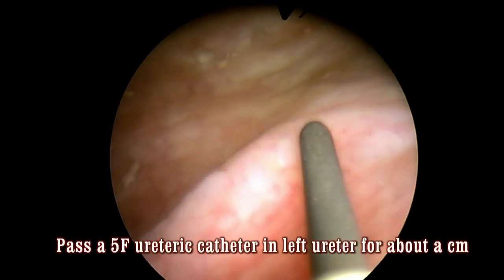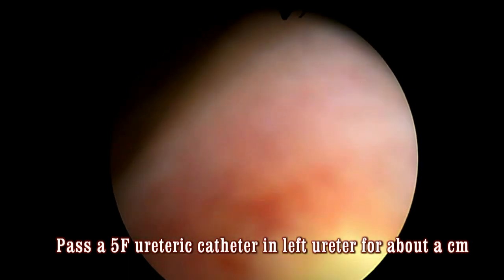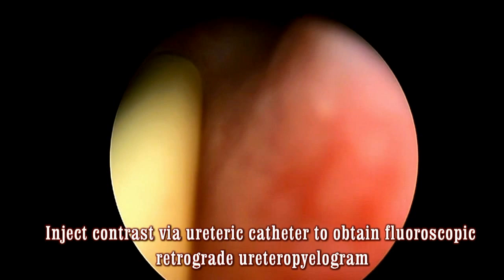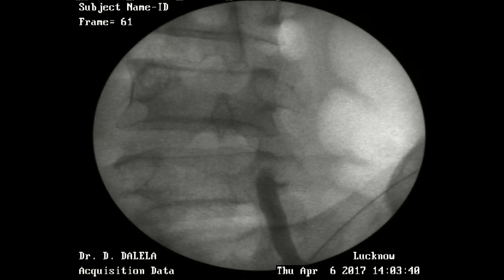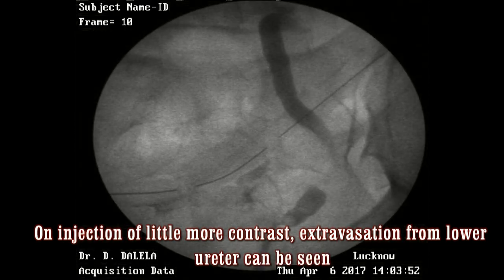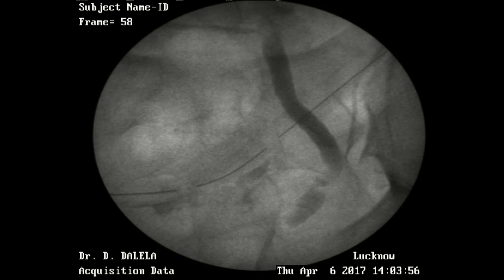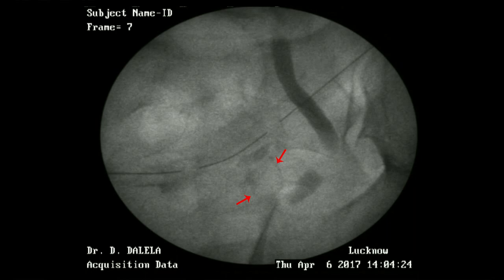Next, you pass a 5 French ureteric catheter into one of the ureters — the left side here — for about a centimeter, and then inject contrast via the ureteric catheter to obtain a fluoroscopic image. As you inject contrast, you will see the dilated ureter, and on injection of a little more contrast, you may see some extravasation from the lower ureter. In this case, the extravasation is going towards the medial direction into one of the vaginal fornices.